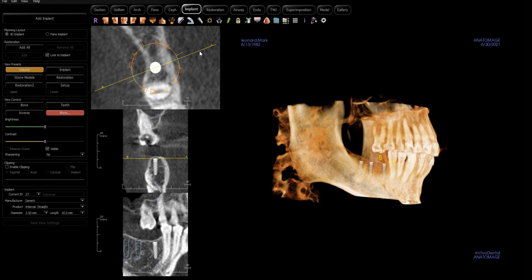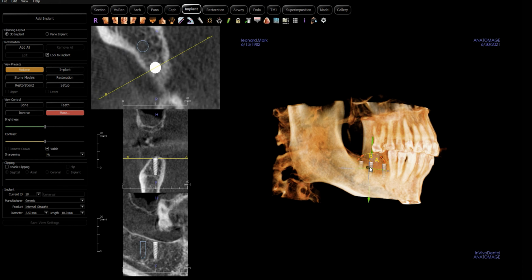And because we're doing so much with this patient moving forward, I don't think there's a point in time we're going to be able to pause it long enough to do all that we need to do. Plus, I think you can pull this off very well freehand. We're going to use the full flap approach so that you can get full visibility to see this ridge, and he has plenty of bone. I just don't think it's a case we need to do a surgical guide.